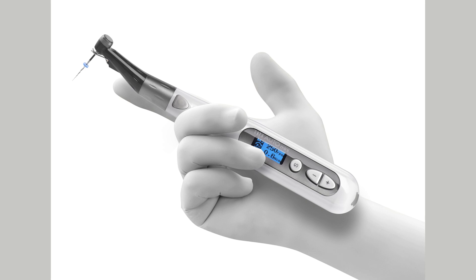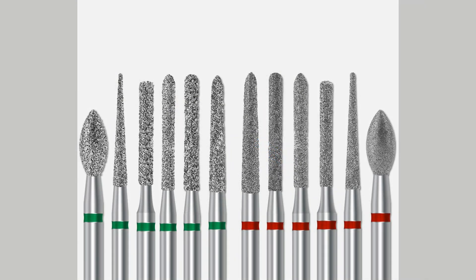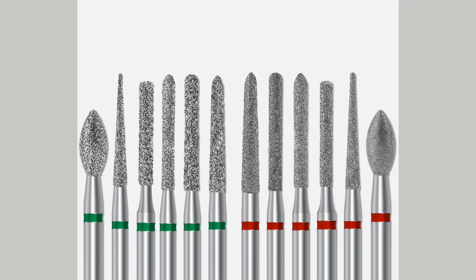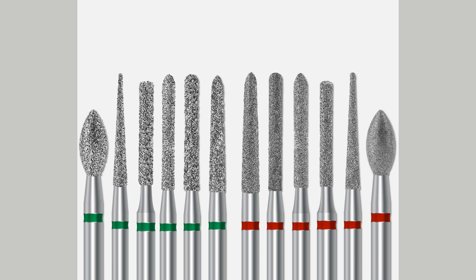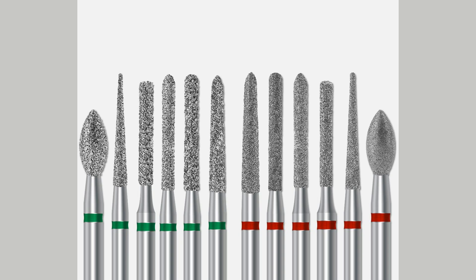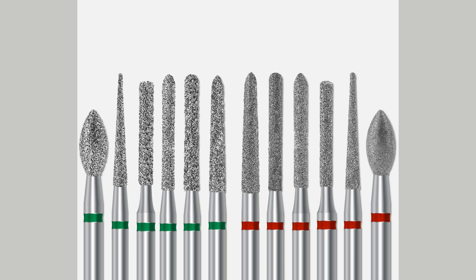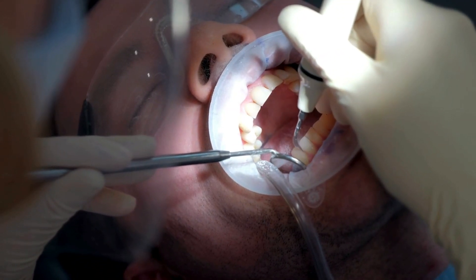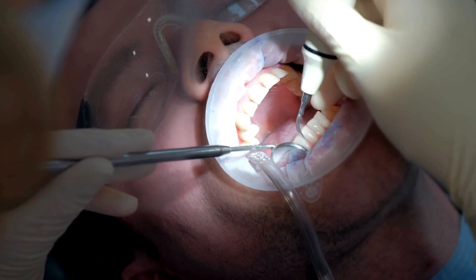Micromotor burrs: small tips that are attached to the end of the contra angle handpiece and aerator, allowing access to the fine details of the tooth. With these tips, decay is cleaned, the tooth is cut, and the filling is corrected.